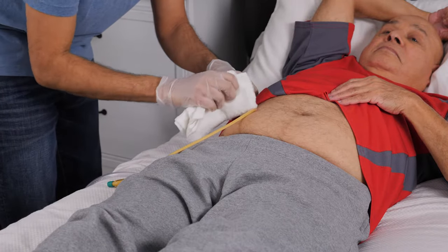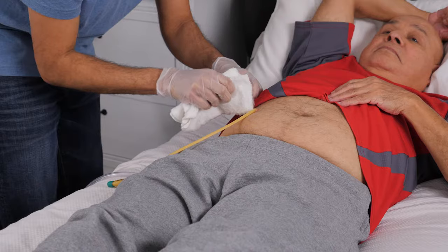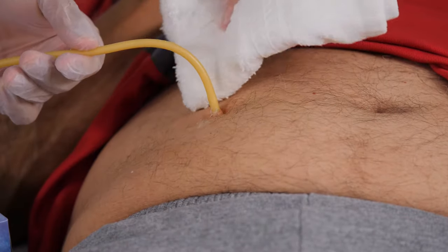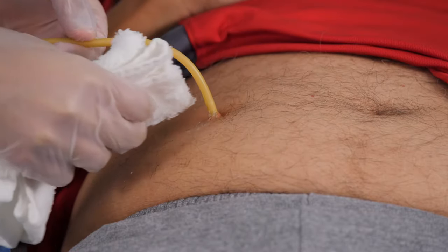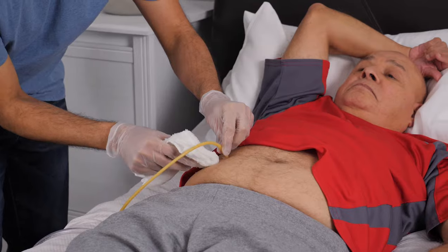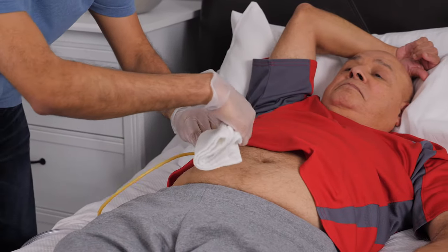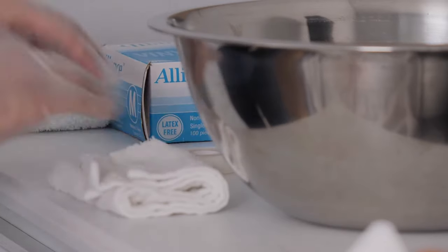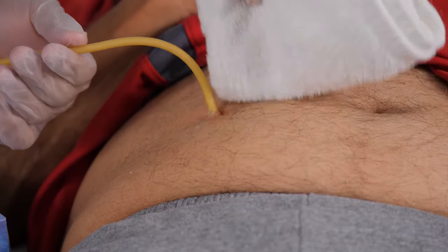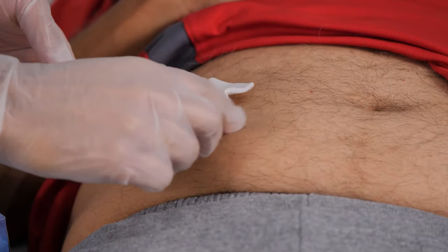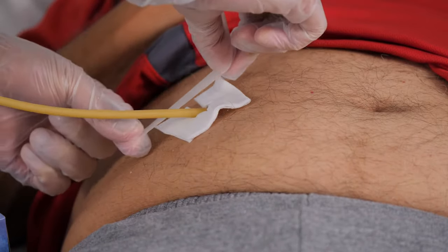When a suprapubic catheter is first put in, it may need to be cared for by a nurse. But once the surgery site is healed, think of it like an ear piercing. It's actually easier to clean. You can wash around the tube with soap and water, starting at the tube and cleaning outward in a circular motion. For both types, once they are washed, rinse well with clean water and pat dry. Sometimes people like to have a piece of gauze placed around the suprapubic tubing like this to make it more comfortable.